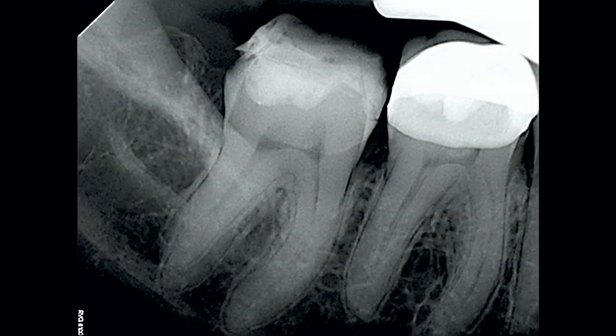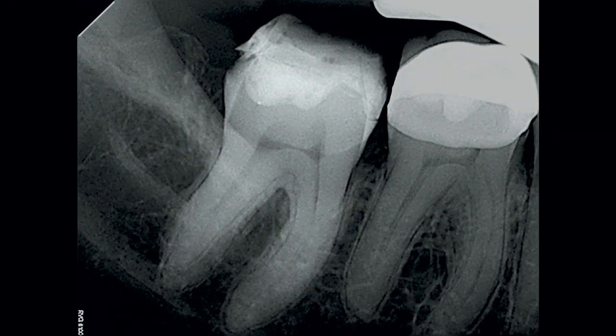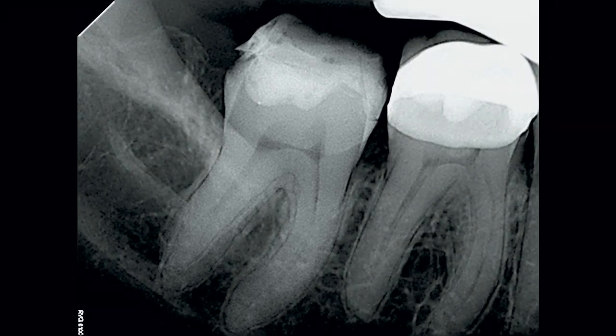The first step to managing these deep canal splits is just recognizing the fact that you're dealing with one, and it starts with reading our radiographic imaging. We're treating tooth number 31, the lower right 7, and I'm going to draw your attention to that distal root complex.